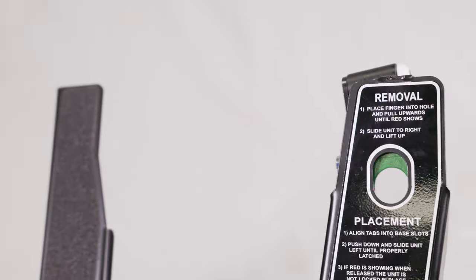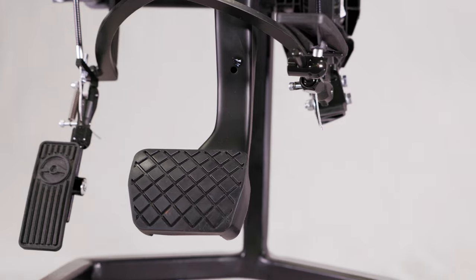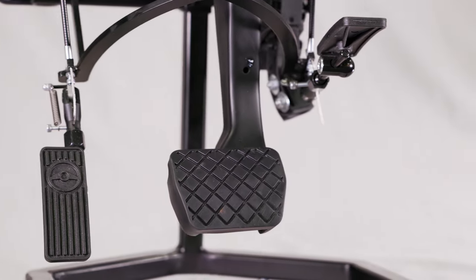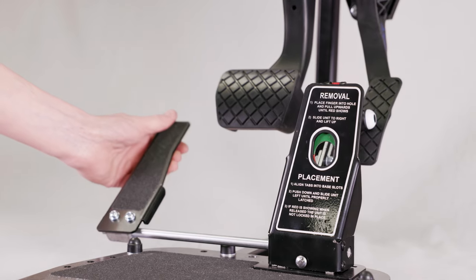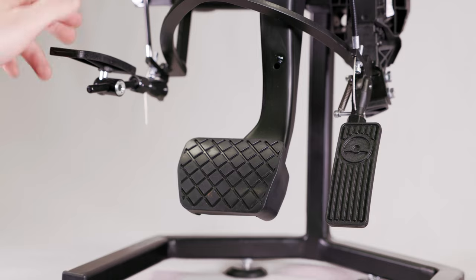If you are unable to operate the accelerator pedal with your right foot, an additional accelerator pedal can be fitted to the left of the brake pedal and operated with your left foot. This is particularly useful for those with a right leg amputation or with limited mobility in their right side, but where hand controls are not necessarily the suitable solution.